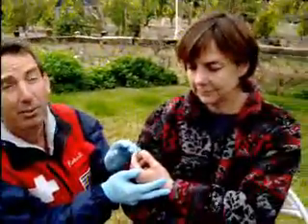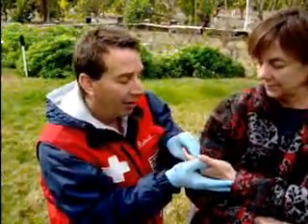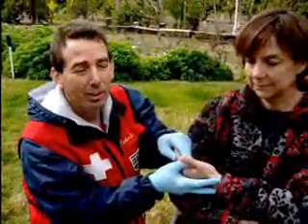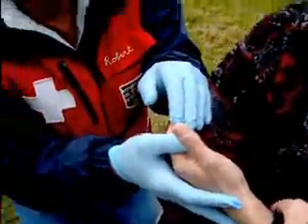I'm going to do exactly the same thing after I splint to make sure I haven't done any harm. The other thing I'm going to do is make sure there aren't any rings, watches, or anything else on the extremity, because if there is an injury here, it's all going to swell up. I want to get those off now while I can.